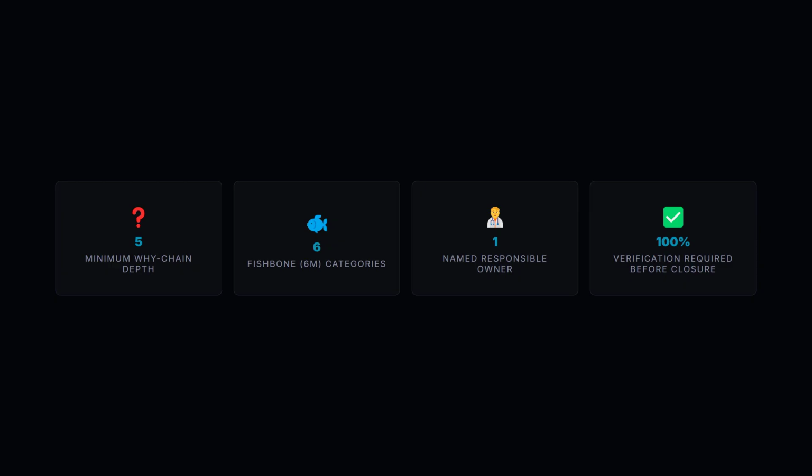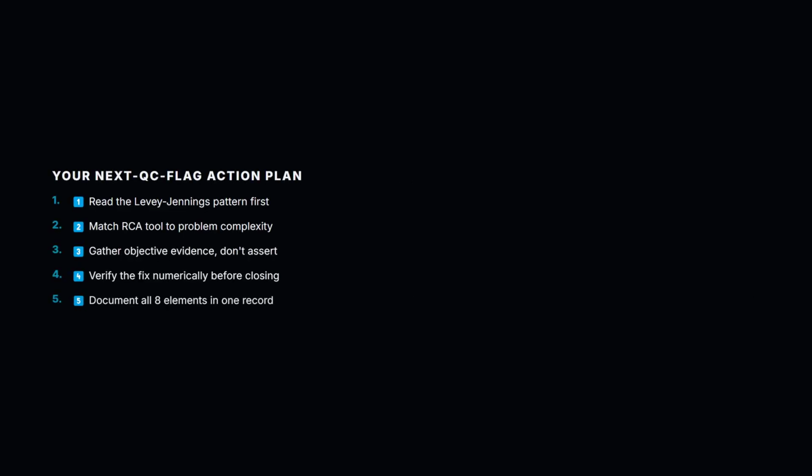So here's your action plan for the next QC flag that hits your bench. Read the Levey-Jennings pattern first. Match the tool to the complexity, 5 Why for isolated flags, Fishbone for recurring ones. Gather objective evidence, don't just assert a cause. Verify the fix numerically before you close. Document all 8 elements in one complete record.